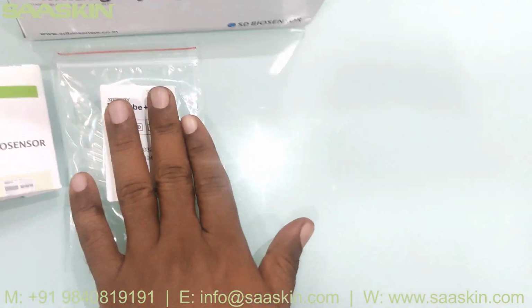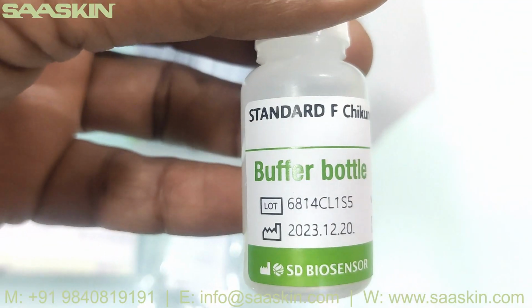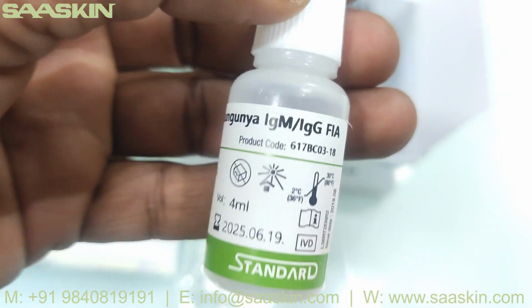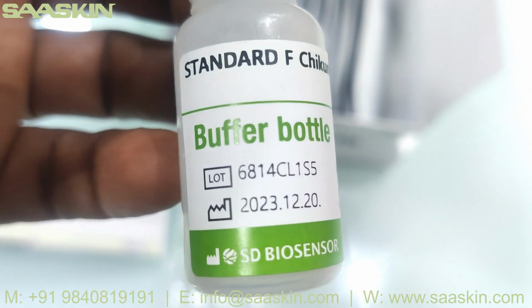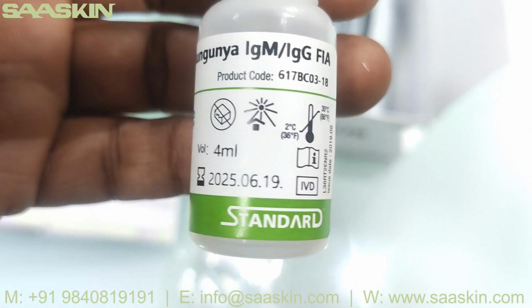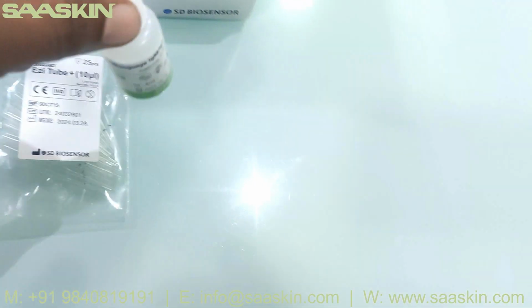And then you have a diluent bottle. It says Standard F Chikungunya IgM IgG FIA. You can see the product code is given, and also the buffer bottle lot number, and the manufacturing and expiry date. It's a 4 ml volume. You can see this here. So just keep this here.